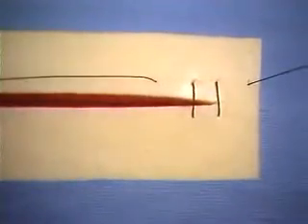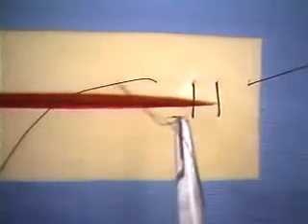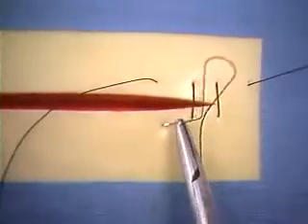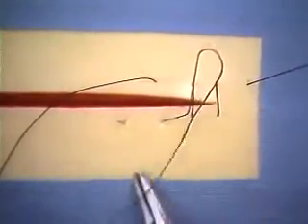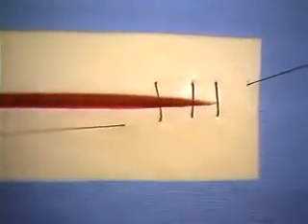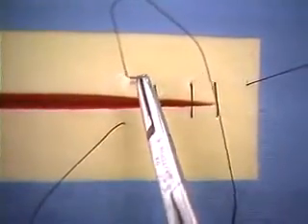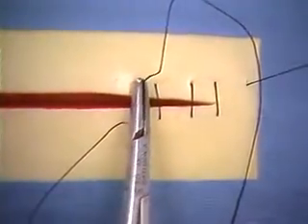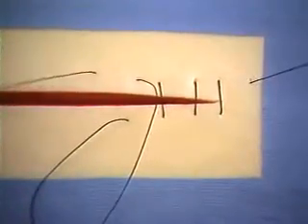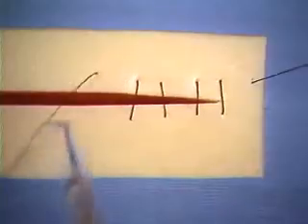From the suture's point of exit, the needle is then advanced parallel to the incision and introduced into the serosa, passing through the muscularis only for 5 millimeters and exiting the serosa on the same side of the incision. The needle is then passed across the incision under the skin and introduced at a point that corresponds to the exit point of the contralateral side.